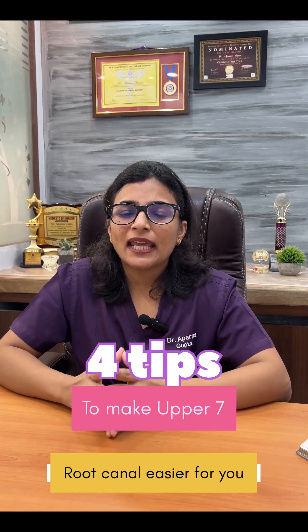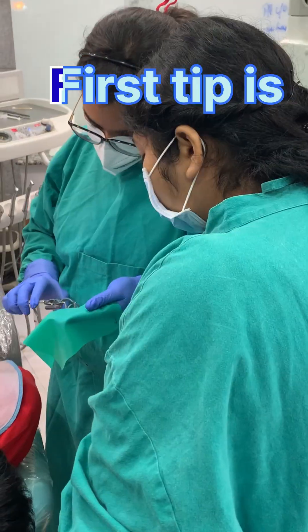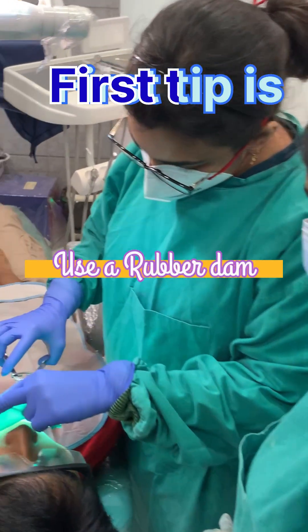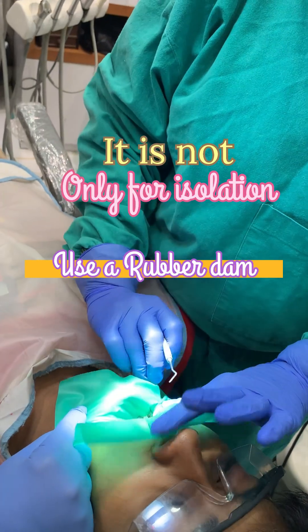Four tips to make upper posterior root canals easier for you. The first tip is to use a rubber dam. I know it sounds very cliche, but rubber dam is not only for isolation.